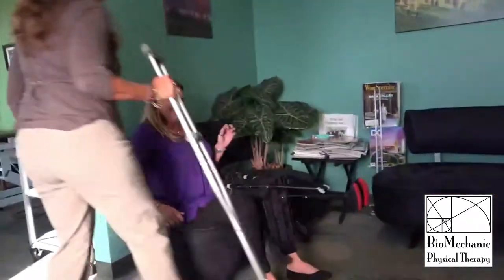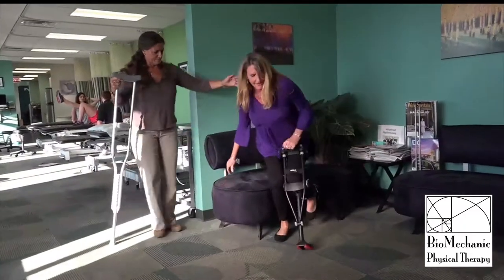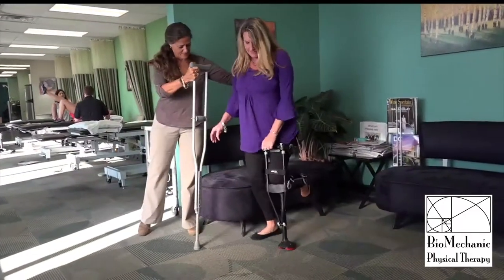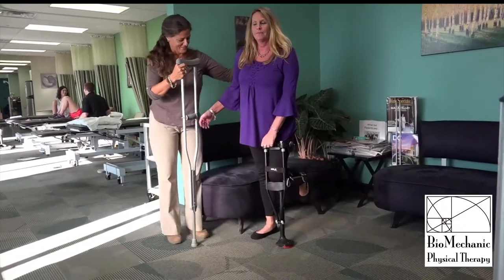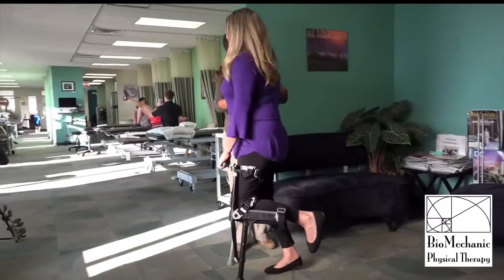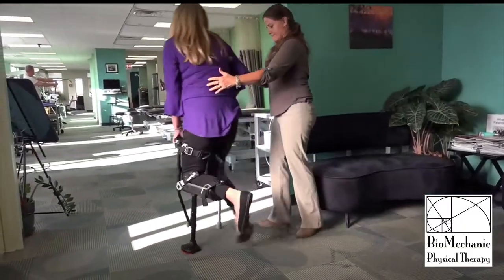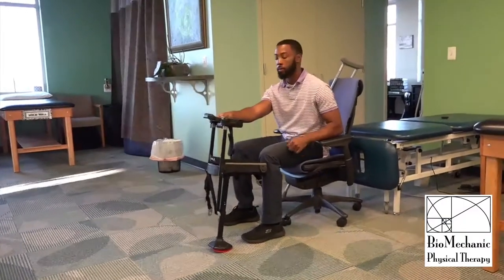Now sitting down, it makes the leg stick out in a funny way. And taking off for round two of walking.